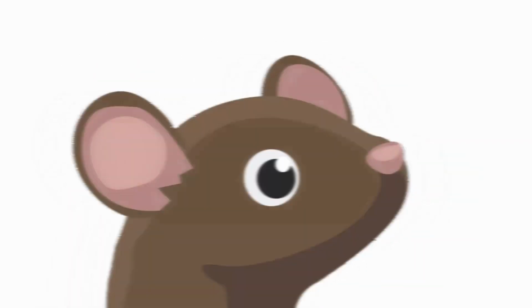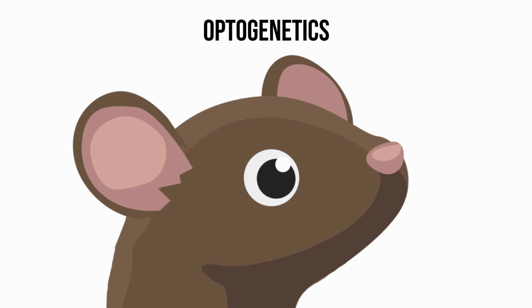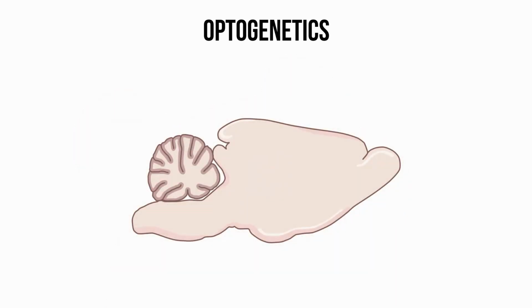Finally, since we are also interested in how activating certain brain areas might alter this feeding behavior, sometimes we use a technique called optogenetics to activate these brain areas. To prepare our mice for optogenetics, we first inject the brain areas we're interested in with a virus, which creates light-sensitive proteins which attach to that brain area's neurons. We then surgically implant a glass rod, an optrode, into their brain, which will ultimately allow laser light to travel into the brain, stimulating the light-sensitive proteins and activating the brain area.